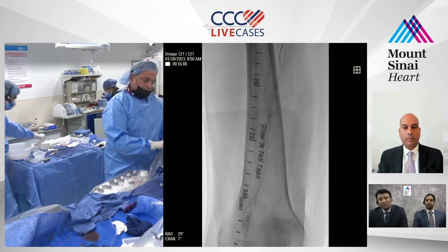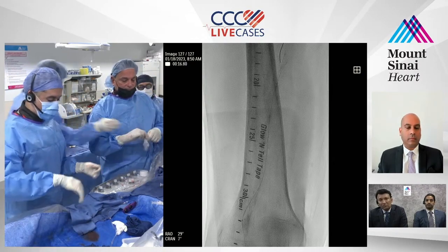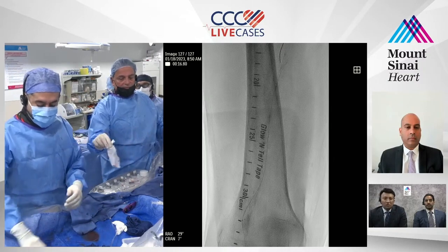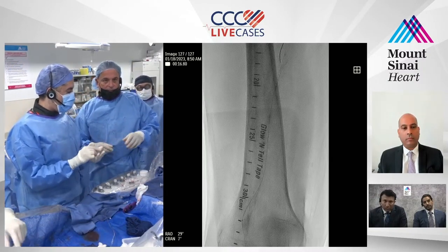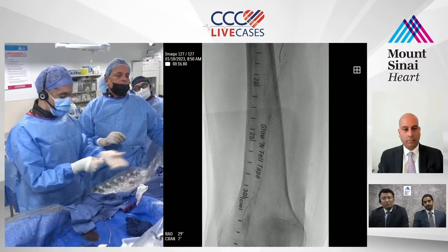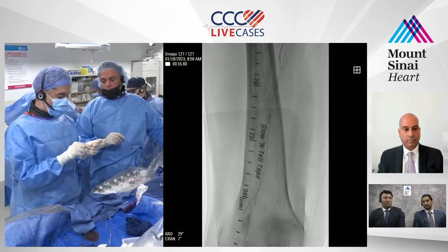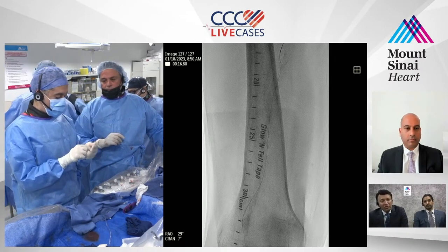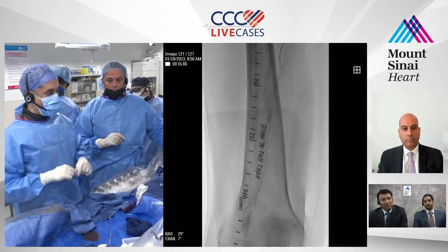Okay, let's go. All right, step one, hopefully right draws there. You guys still have the infusion running through the sheath of the nitro and all? Yep. PK, question. In your experience, Srini and Ajit and Vishal, anybody? I mean, of course, you, Raman. What do you guys think? Pioneer is much more bulkier than Outback in general.